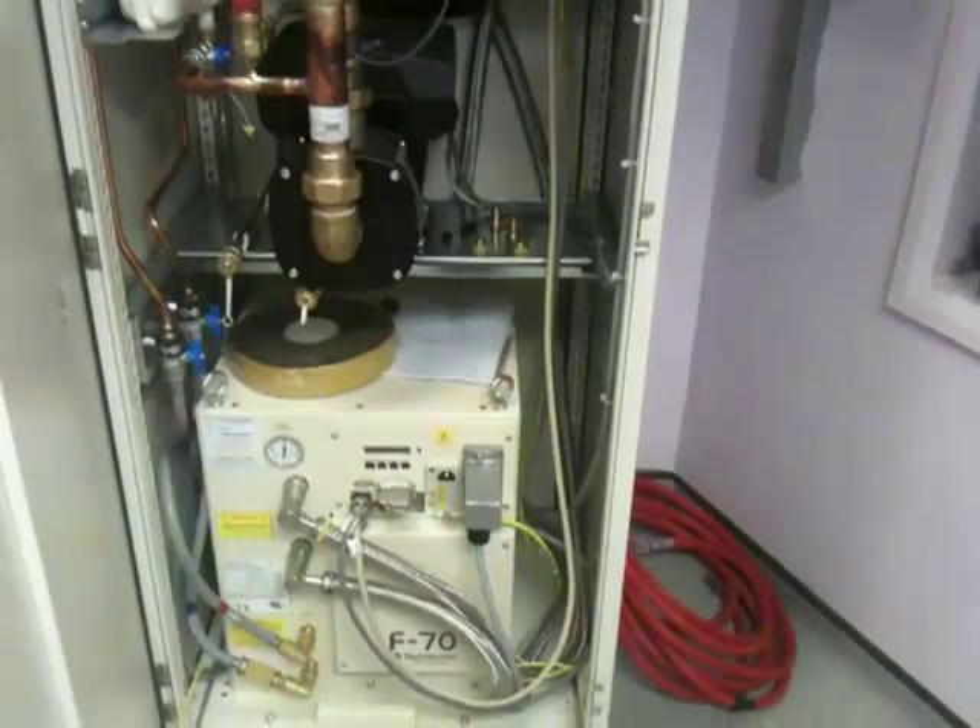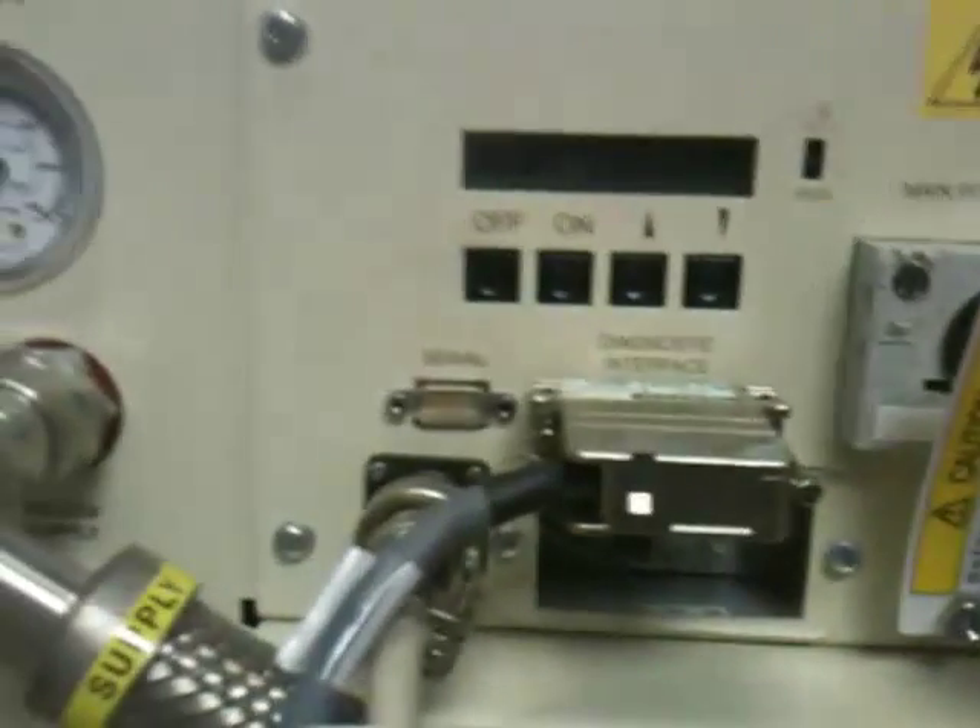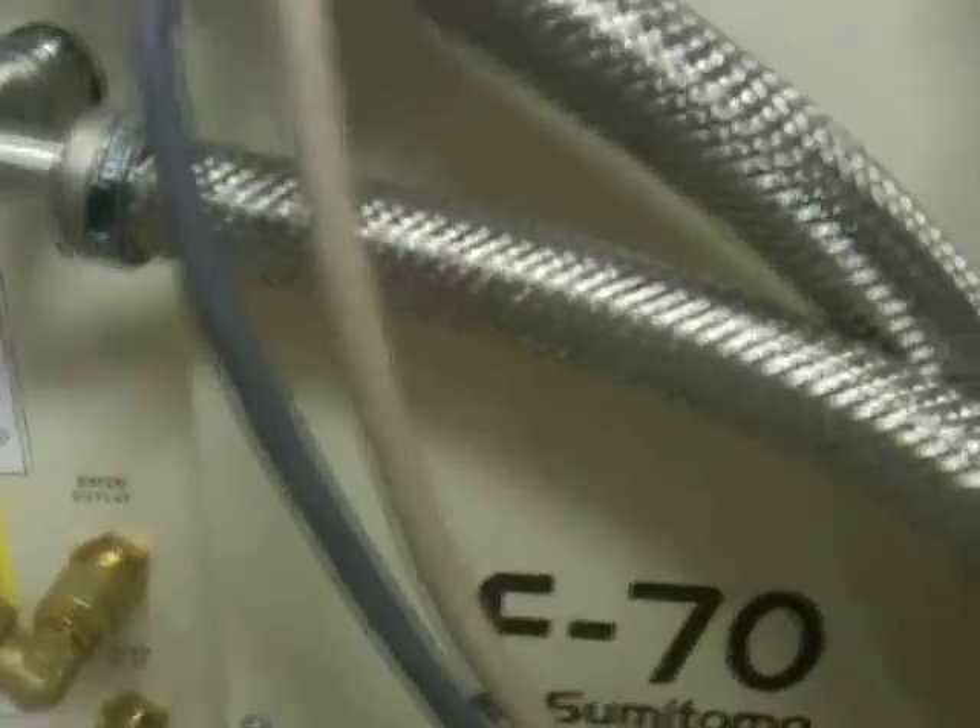At the bottom we have a Sumitomo Cryogenics F70 compressor. It reads 98.4 — not sure what that means. There's a main switch, power connector, assorted other cables, a few buttons, and helium hoses running off out to the back cabinet.